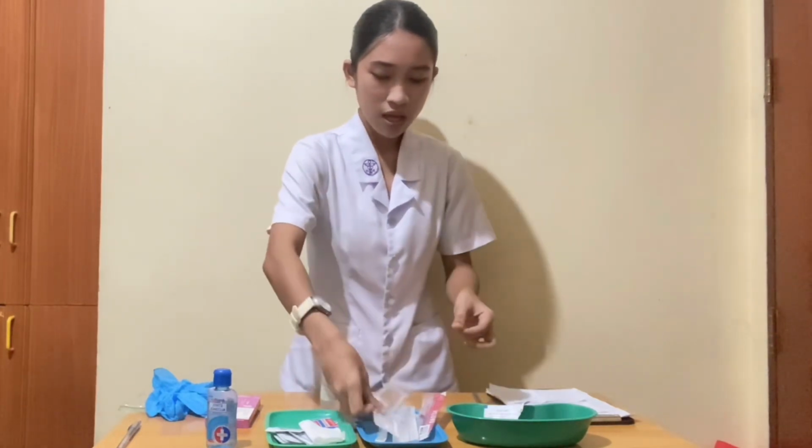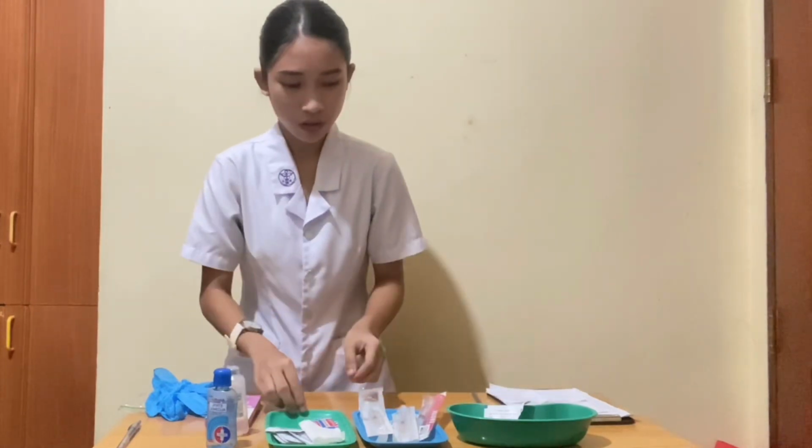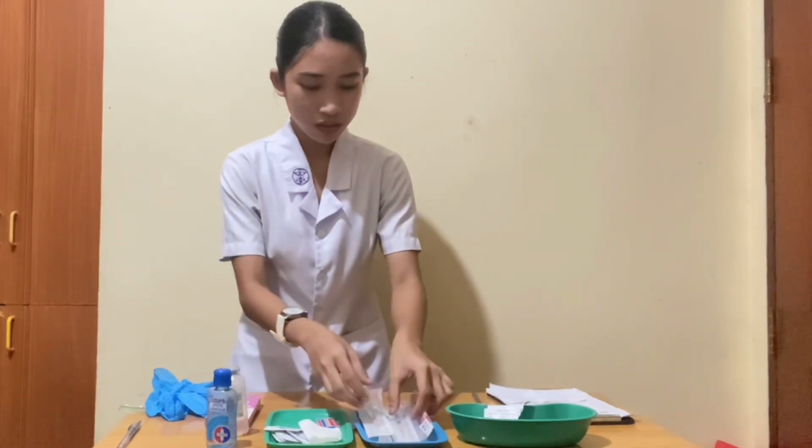Done. Now I'm going to read again the label of the medication and place it in the medicine tray.